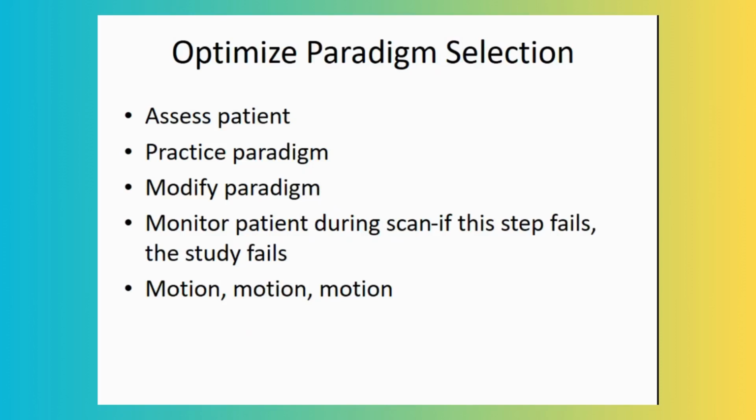So we can modify the paradigm according to the language, according to their education level, comprehension level. And also we ask the patient not to move because motion is the killer. If motion is there during the scan, then these small signals will not reach any kind of significance.